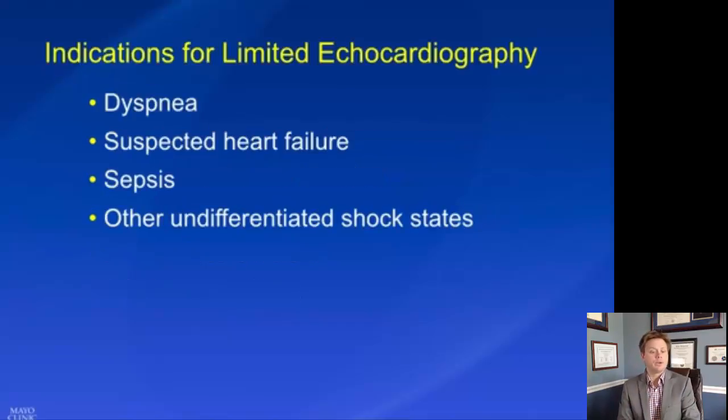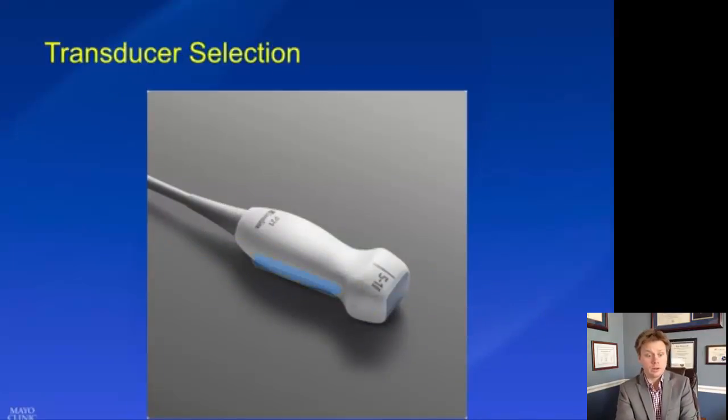So why are we going to want to do a limited echo at the bedside? Well, really any patient presenting with new dyspnea, suspected heart failure, undifferentiated hypotension or other shock states, or in sepsis, it's good both to get a baseline to either confirm your diagnostic clinical suspicion or to help guide the next steps moving forward.